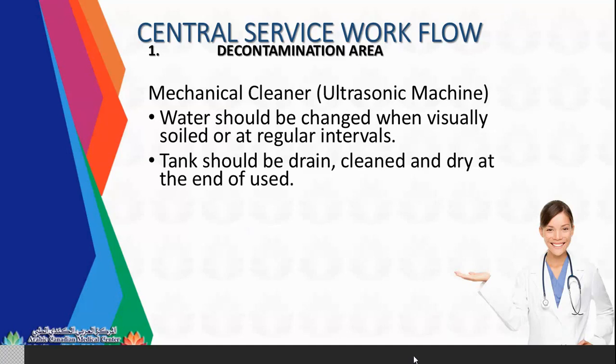For the ultrasonic machine, please bear in mind that there are quality checks to be monitored daily and weekly, actually. We are using foil tests. I'll try to search later on YouTube so that you can see what a foil test is. A foil test uses tin foil or aluminum foil, the kind you use in your kitchen. You need to cut it in a rectangular or square form, and then soak it in the ultrasonic machine for 60 seconds. Once you remove the aluminum foil, it will be perforated. So it has holes in that aluminum foil.